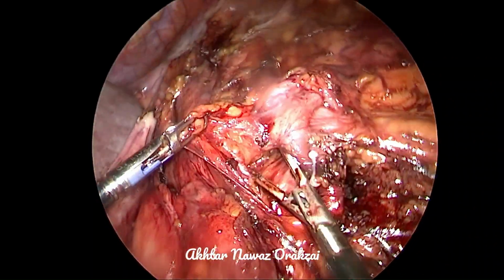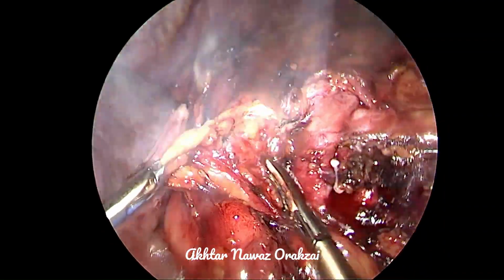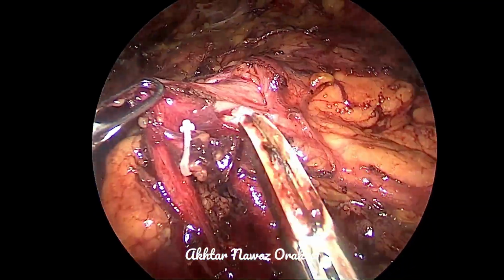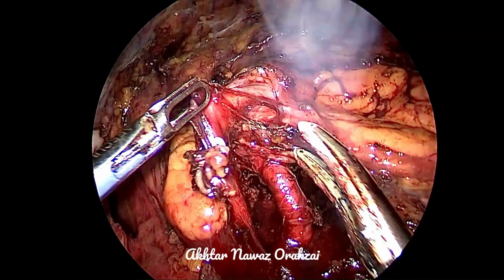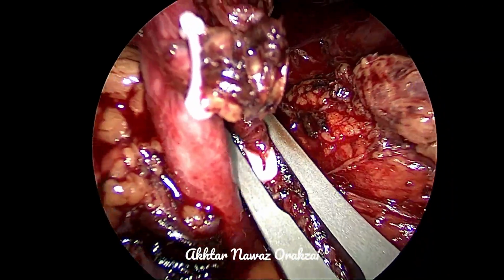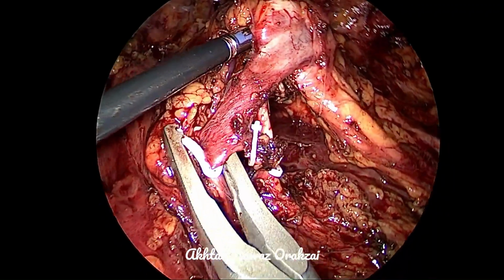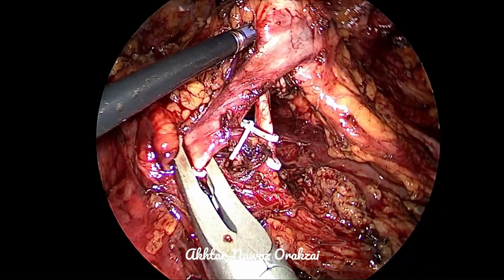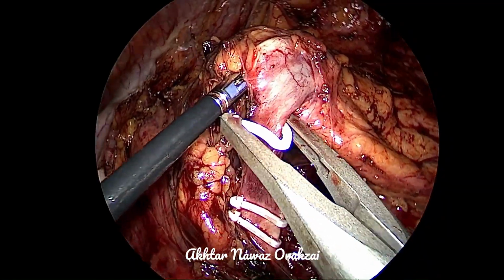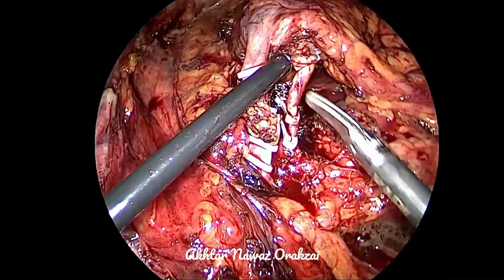Now we dissect. Instead of applying a single clip on the artery, we dissect the renal vein as well, so that all of the clipping is done in one setting. However, in routine, I usually prefer to dissect the artery enough to place a clip, and then I dissect the vein. So we place 2 clips towards the big vessel, 2 clips on the vein towards the big vessel or the midline, and 1 clip towards the kidney. And then we divide in between.